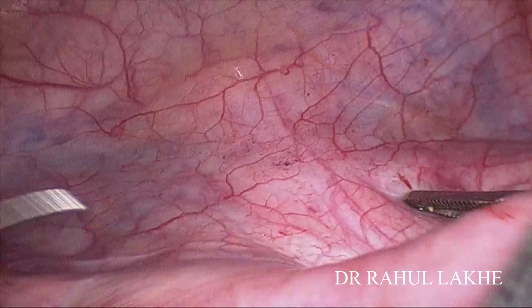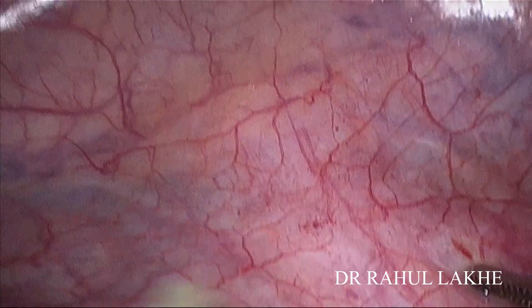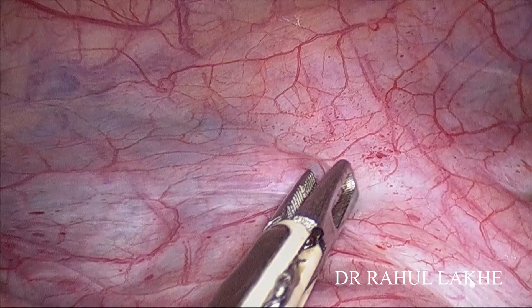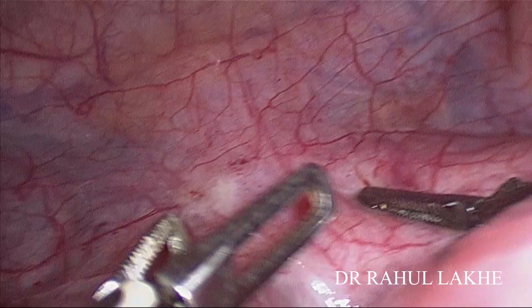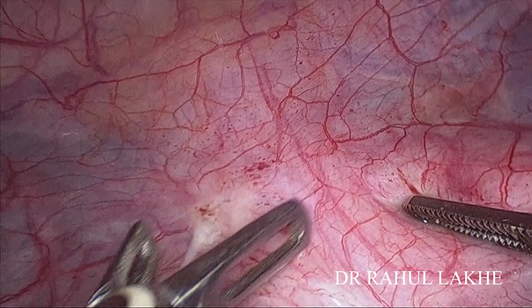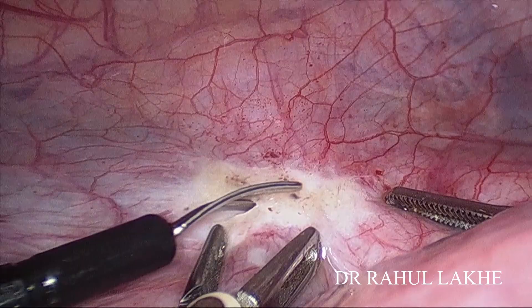The first step of the surgery is to open the utero-vesical fold of the peritoneum. The bladder is demarcated. The anterior fold of the peritoneum is cauterized — we have a bipolar in the right hand and scissors in the left hand. The cauterization is started and the anterior peritoneum is cut. The incision is extended.